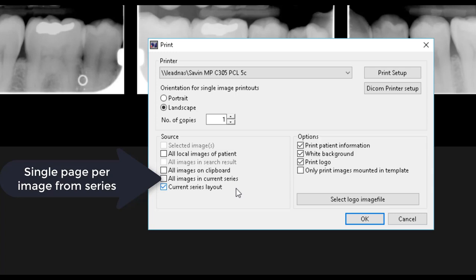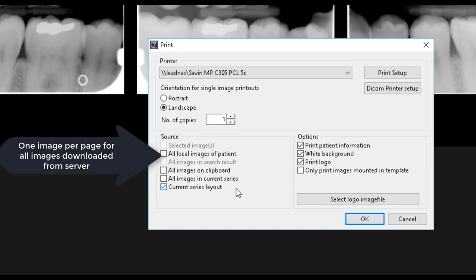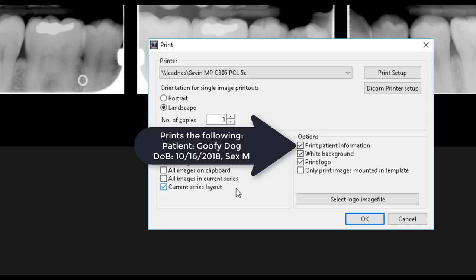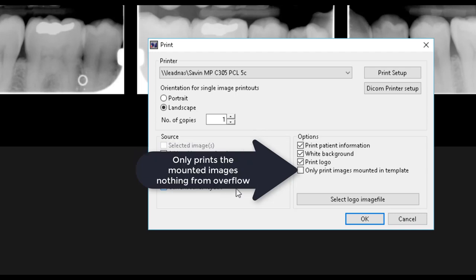Otherwise, each image will be printed on one whole page, potentially wasting ink. After you have selected your source, you can select from the numerous options to print the patient info, apply a white background, print a customized logo, or only print images mounted in the template.